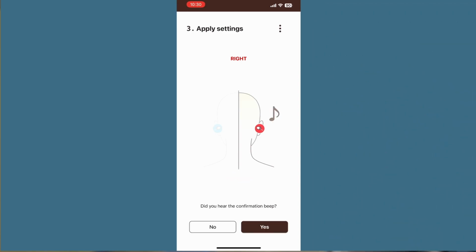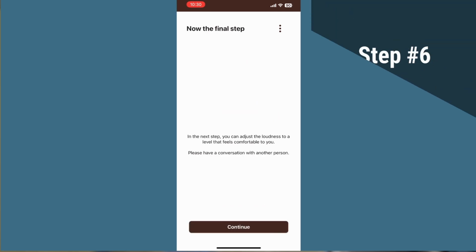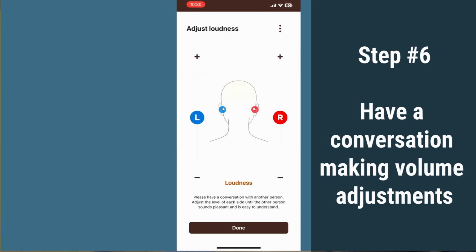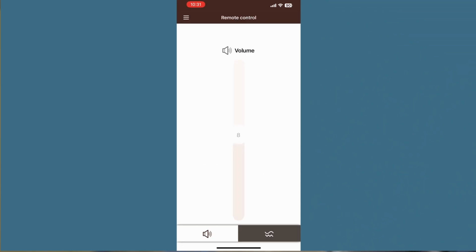Perfect. Once you've applied the settings, the app is then going to ask you to have a conversation with someone, allowing you to turn the volume up and down, adjust it so it's comfortable. In this case, our patient found the hearing aids to be fairly comfortable. We're going to do some measurements in a few minutes via real ear in order to determine exactly how it's working compared to their actual hearing loss. Once you find the volume that's comfortable for you, you then are given the volume control bar on the app, and you're pretty much set up.